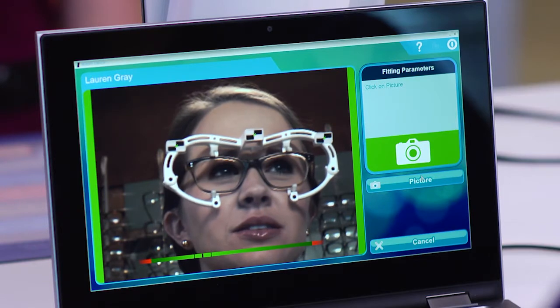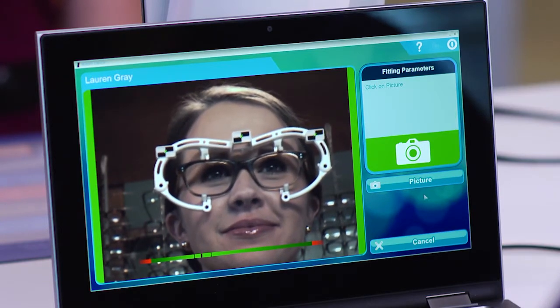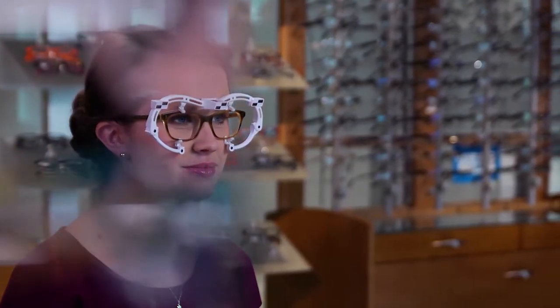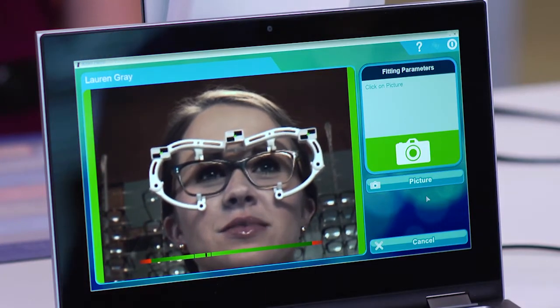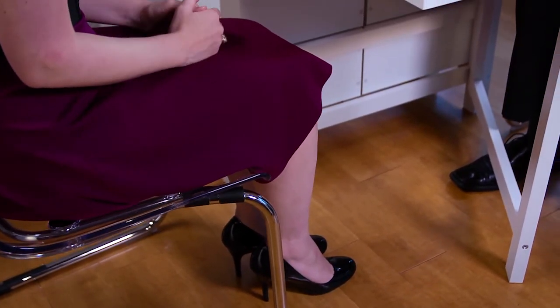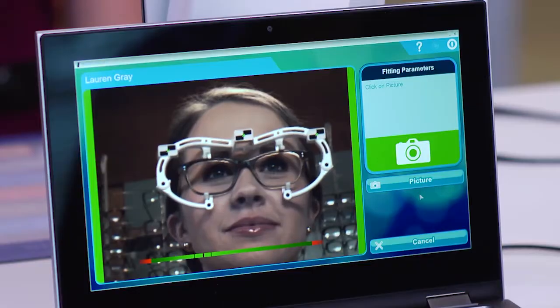Once the patient is properly positioned, ask her to look straight ahead into the distance and move her head slightly from right to left so as to assume a natural posture for looking into the distance. Move slightly to one side to get out of the field of vision. The patient's gaze into the distance should not be disrupted or distracted while the measurements are being taken. The patient should be relaxed, with her feet flat on the ground and hands resting comfortably on her knees. Check that the frame is still properly adjusted and the patient has a natural posture.